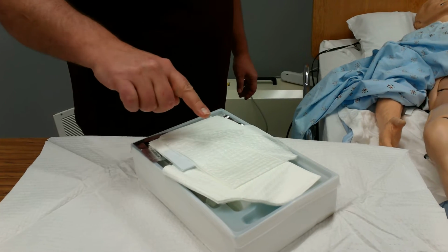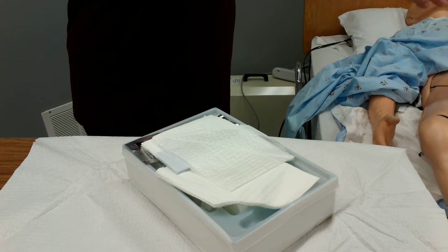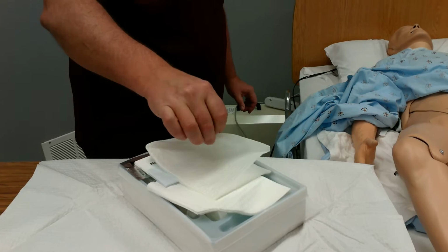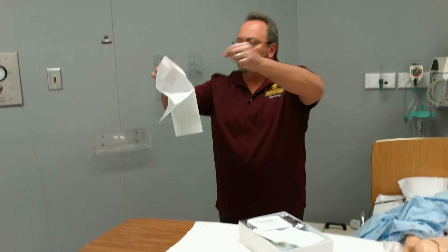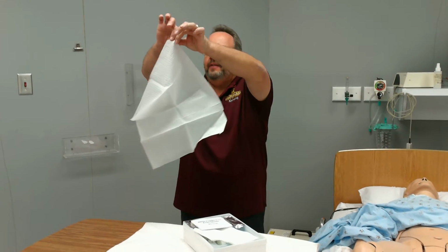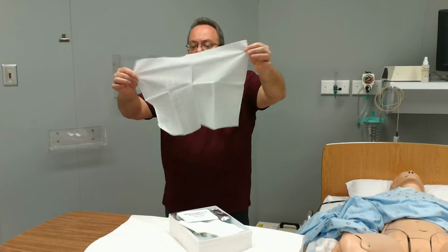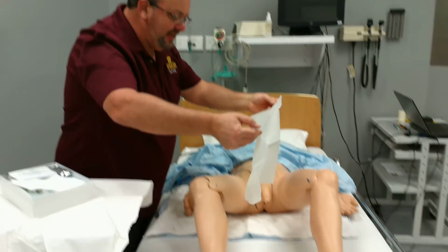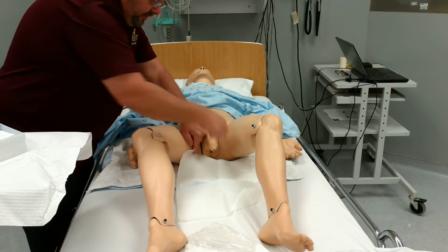Now, if you look at this flap here, you can see that it has a fold on it. And this fold has a shiny side and a dull side. That shiny side is the side that's going to go down. So it's folded like that so that you can touch that shiny side without contaminating the other side. Here, I'm going to step away from my sterile field. I'm going to open this, and if I have to, use my 1-inch border all the way around just to open it up. I don't want to shape this. Then this lays shiny side down right in between the legs, thusly.